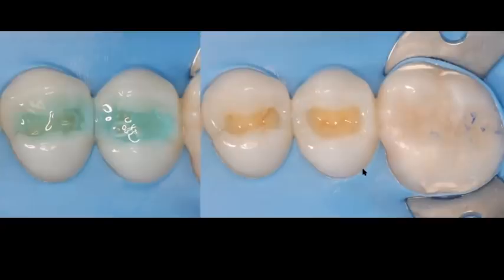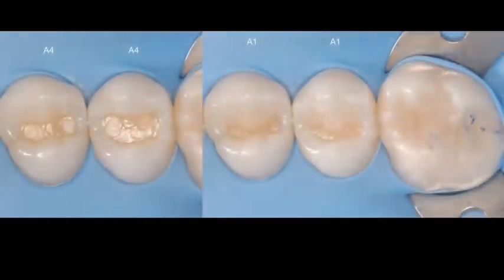So with a brand new micro brush, you get into your preparation, you absorb some of the excess, and then you can dry it on a napkin or on the patient's bib, and then you go back in 2 to 3 times until you get a nice and even layer thickness around your entire preparation. Once you have achieved that, I always recommend using a gentle stream of air, 5 to 10 seconds, to eliminate the solvent that normally is part of our dental adhesive, and then you go ahead and light cure. So once you light cure, we're ready to restore.